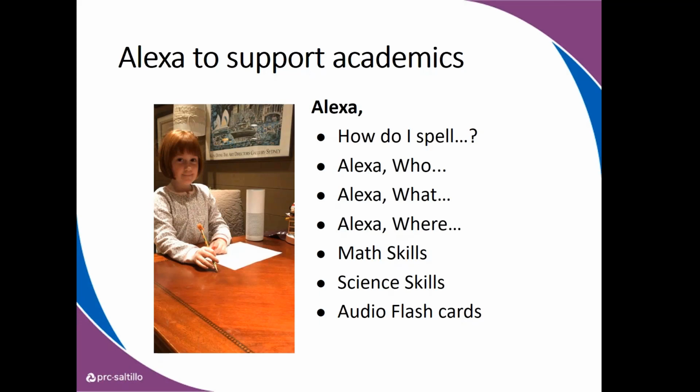One of my favorite stories with Alexa, I have a little one who actually uses 2-switch scanning with her NovaChat device, and she has pages and pages of her favorite pop idols, and it's filled with Taylor Swift and Adele, and she can quickly ask for any of the music she needs to, because she really doesn't have the physical access to use another device to do that. And what more does a 13-year-old girl want to do than to listen to music? So you can do so much for independence, for fun, and also for academics.